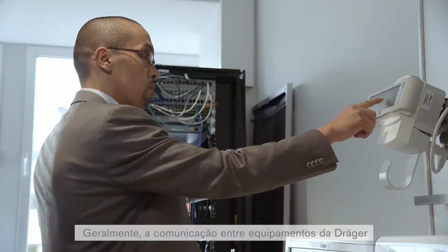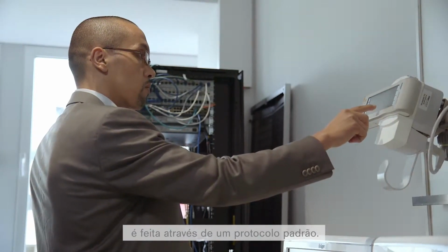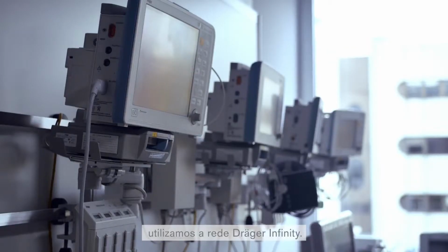Currently, for the communication between Draeger devices, we use a standard communication protocol, so it's a serial communication between devices. We collect information such as waveforms, alarms, trends, and the settings coming from our ventilator, such as the Evita V500. When we need to communicate that information to our clinical information system, we use our Draeger Infinity network.